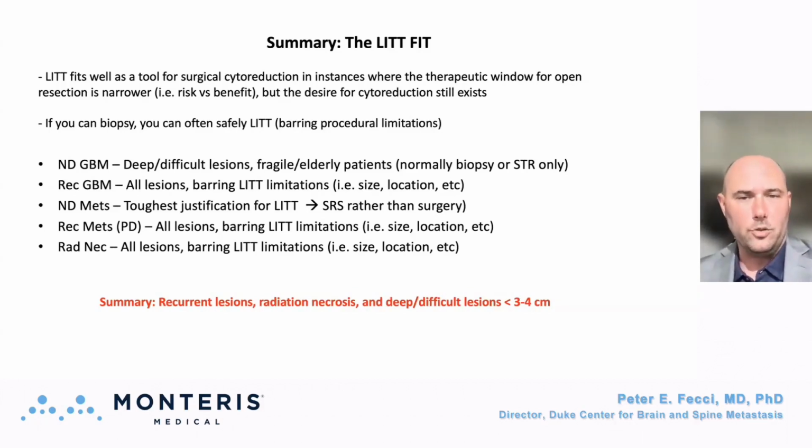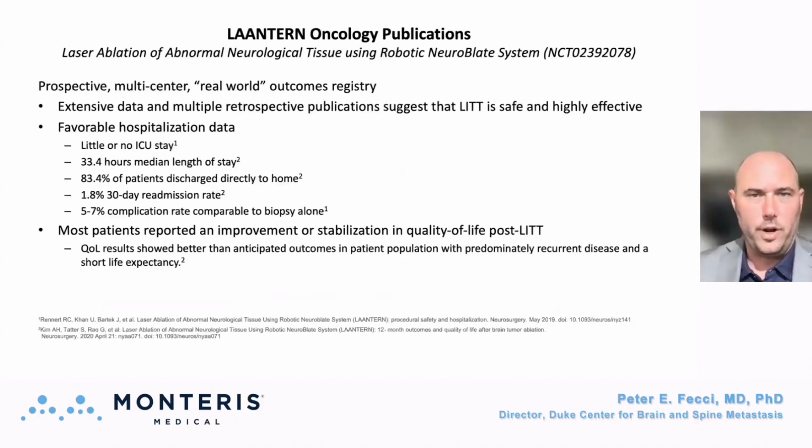This is really your wheelhouse for this procedure, and it does extremely well if you choose your patients correctly. And I think you can see evidence of that right here. This is really the largest registry of patients who've been treated with the LITT procedure for oncology nationwide. This was the Lantern registry, a prospective multi-center real-world outcomes registry, collected at the end of the day over 1,000 patients. And what you can see is that there are some real advantages to this procedure.